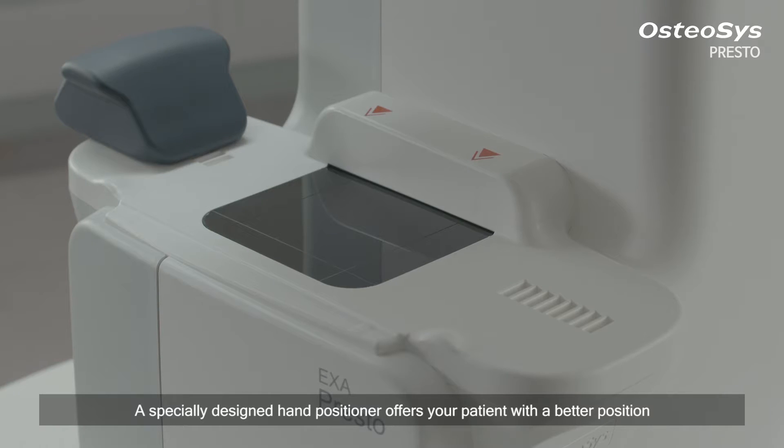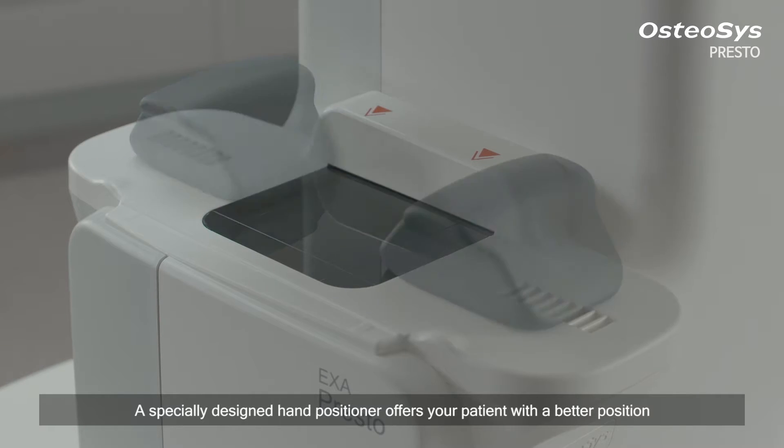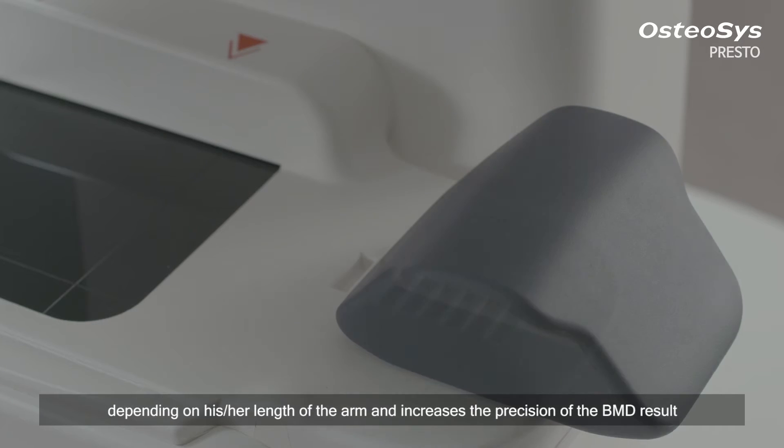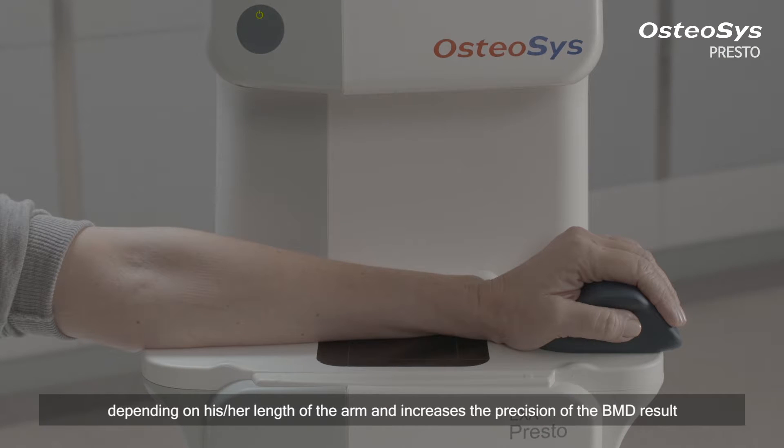A specially designed hand positioner offers your patient a better position depending on the patient's length of the arm, and increases the precision of the BMD result.